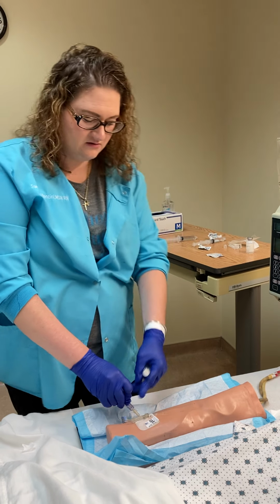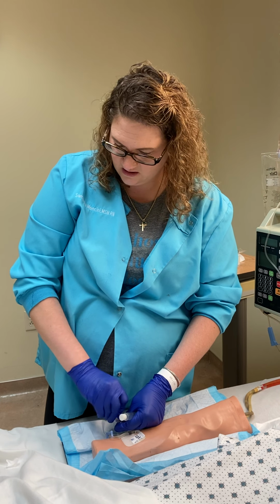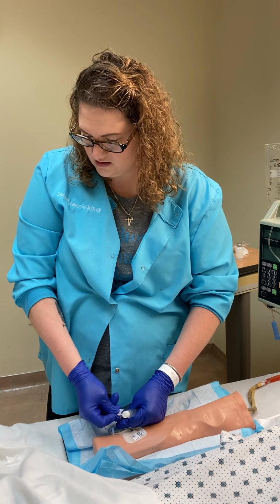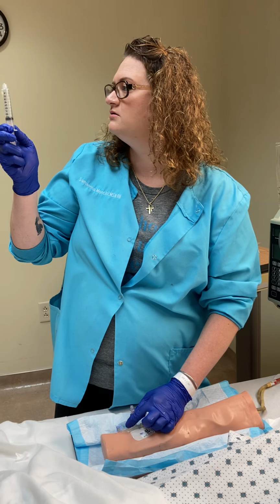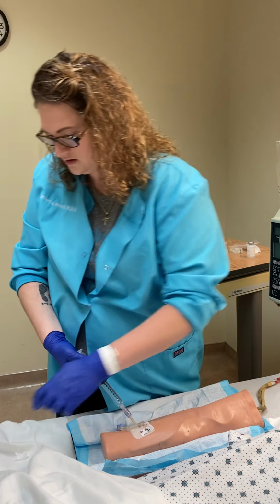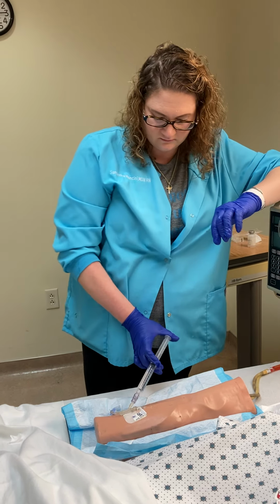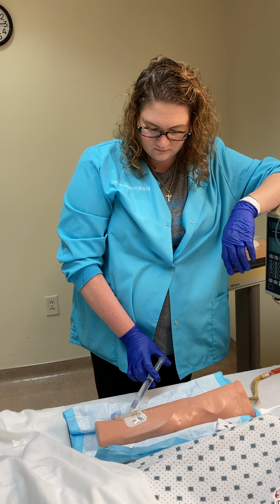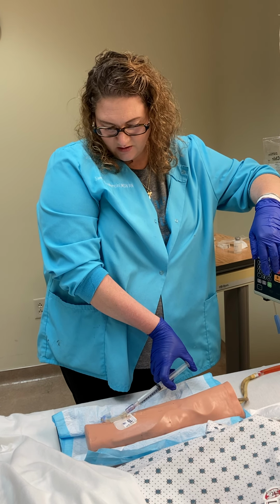Clean for 15 seconds again. And then we will attach the flush. And we need to push the flush at the same rate as the medication. So about 30 seconds per half ml.